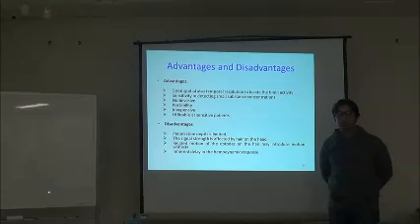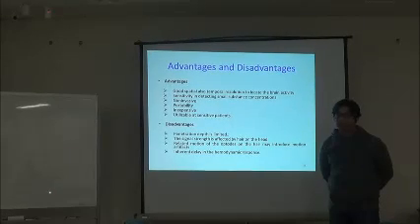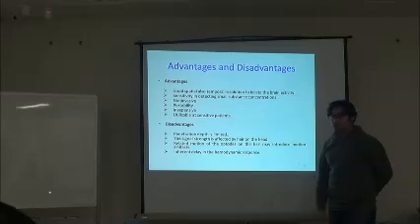Because for brain-computer interface, if you want to use it for communication only, maybe 2 or 3 seconds do not matter much. But if you have to control a robot or a prosthetic arm in real time using fNIRS, this is a huge delay. So this is the first part of my lectures.